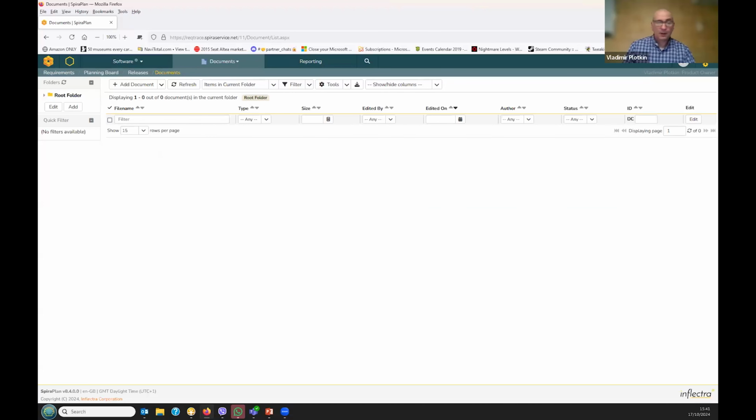One of the things I didn't mention yet, but I will now, about tools, is that once you've got tools in SOUP, it's quite important to freeze the versions. Because, for example, you've probably seen this when you come into your office and Windows has updated some drivers and your printer doesn't work anymore.